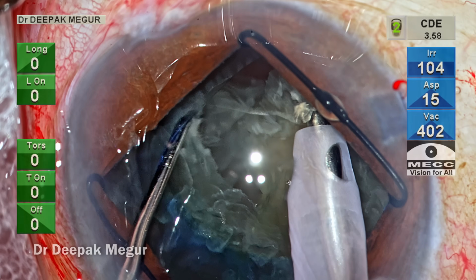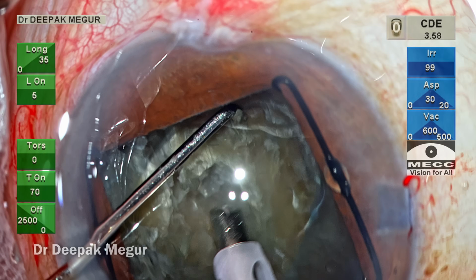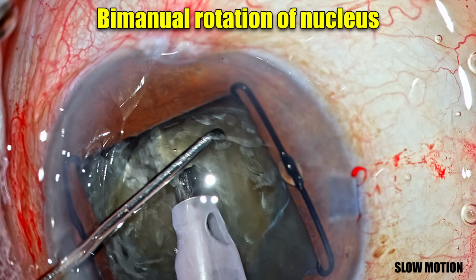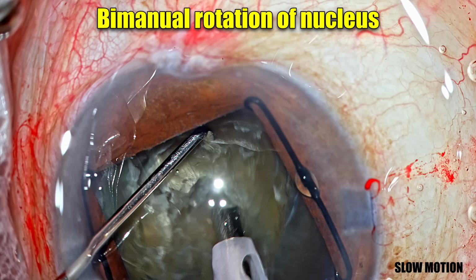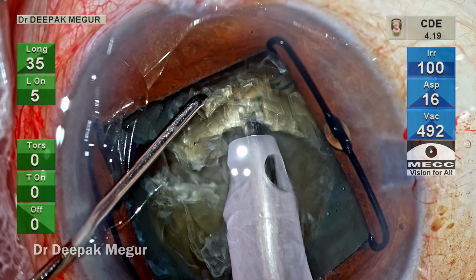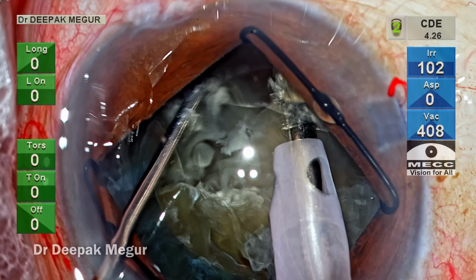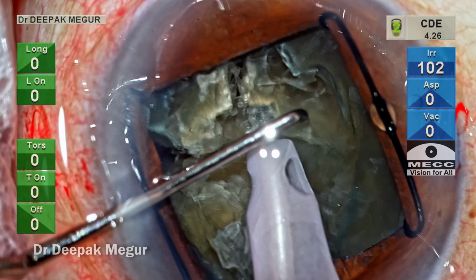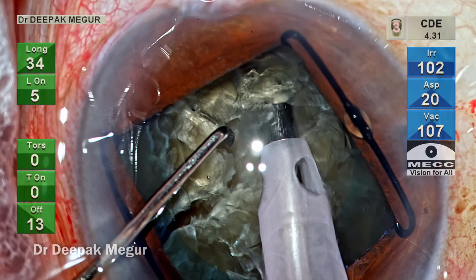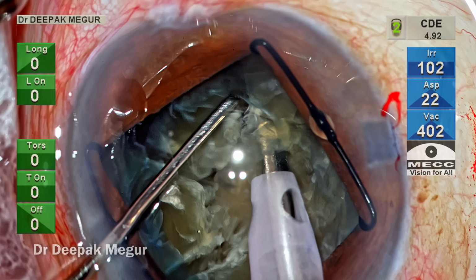I'd like to draw your attention to the way I maneuver the nucleus. You can see I'm going to use the 2 instruments inside to do the rotation. It's bimanual rotation. I'm going to use both the chopper as well as the phaco tip to rotate. Now this maneuver is very helpful in rotating the nucleus without using excessive physical force. This technique is really helpful when we are dealing in such eyes with compromised zonules. So using two instruments to rotate the nucleus would be the best use of the physical forces without causing significant stress on the already compromised zonules.